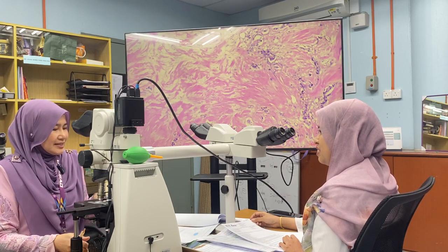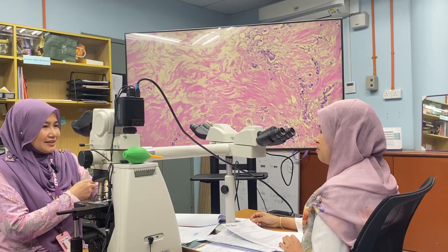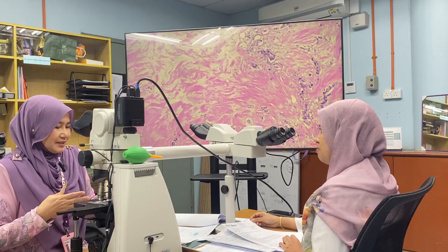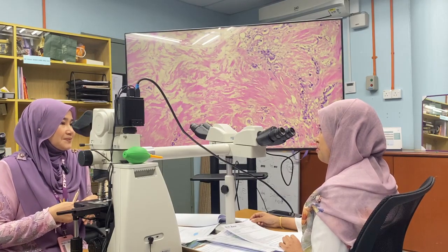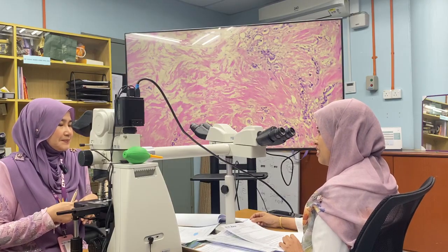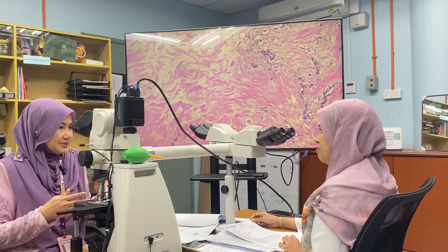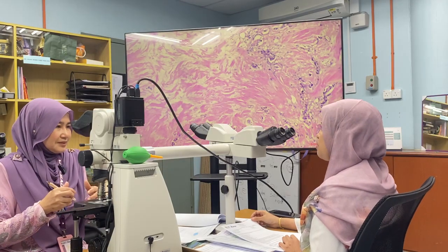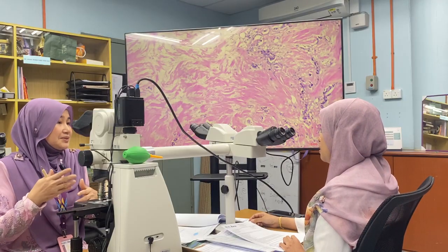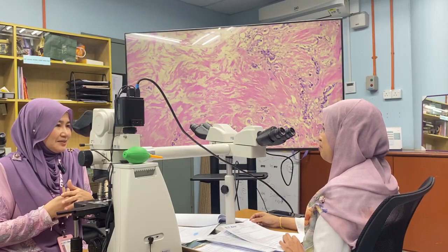While examining the lymph node, do you assess all the post-chemo pathologic changes in the lymph node? In this case, yes. And when you detect any changes, what do you need to do? You need to describe it in your description. All right.